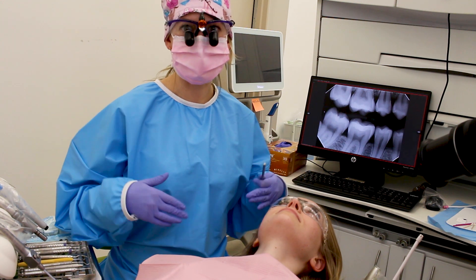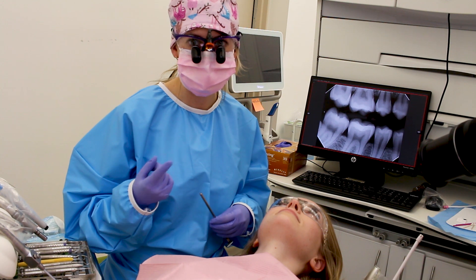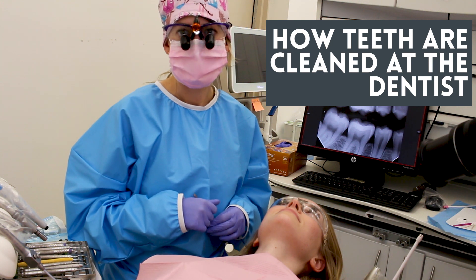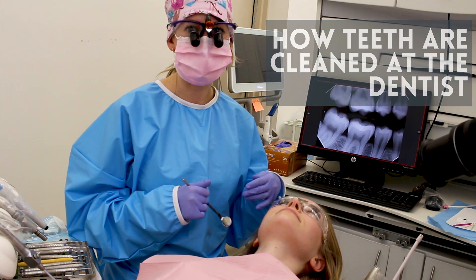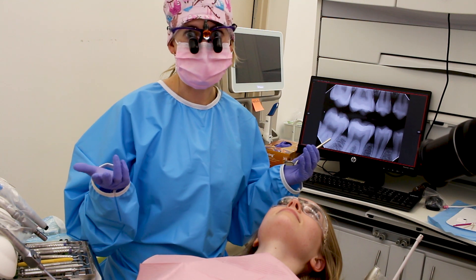Hey, welcome! This is my get-up for work — this is what I look like. I have my loops on so that I can see, and it's got my light on it. I have my nice little scrub cap, thank you COVID, and my super warm surgical gown. This is my patient here. We are going to do a cleaning today, and I'm going to show you the steps and the different things that we use. Let's dive right in.